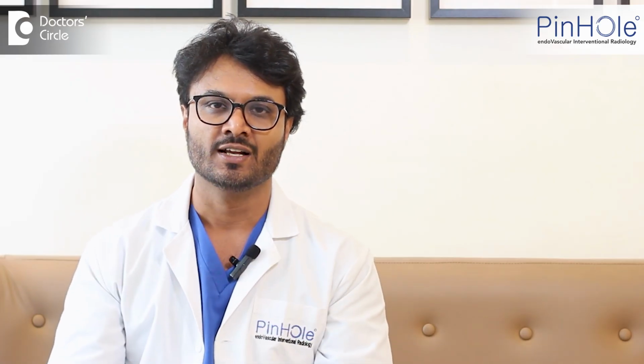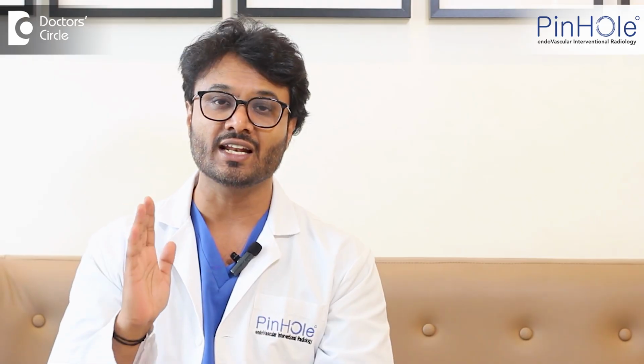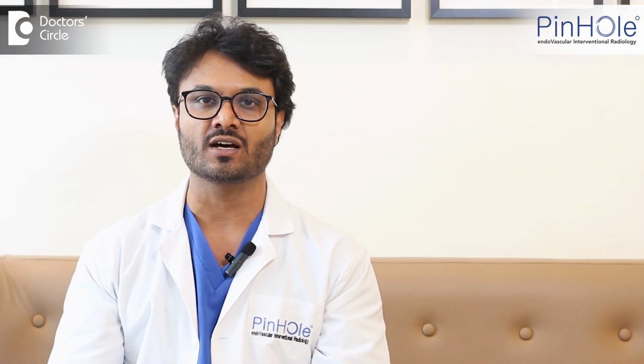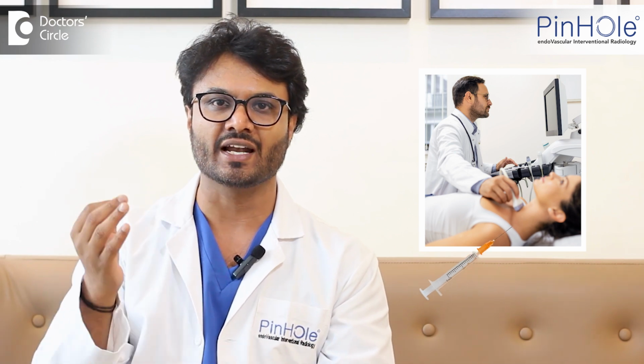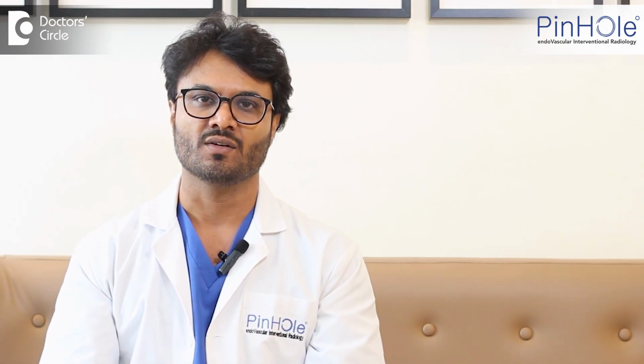Now, let me come to the key point of this procedure, that is, this is unlike the olden days where they used to open up to do these biopsies. Here, we do not have to open up the patient. It happens through a pinhole. It's a daycare procedure. Come, get it done, observe for 2 to 3 hours, and then go back home. The tissue processing takes around 48 hours to get to know what is the tissue and what is the diagnosis. Based on that, then your treatment starts.